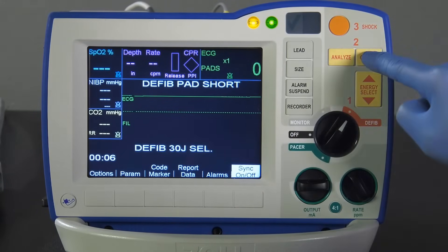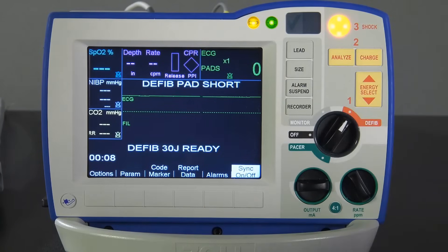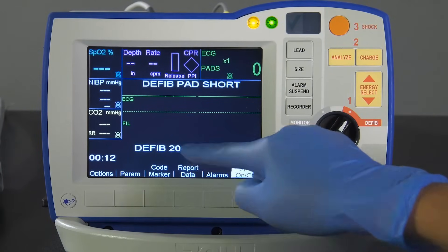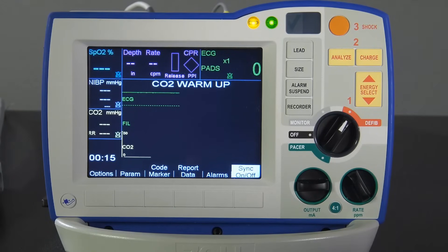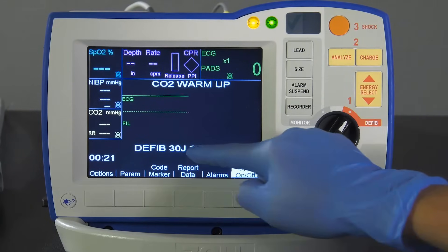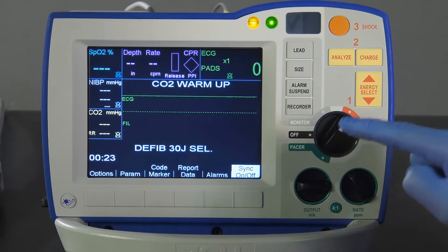When the Charge Ready tone sounds, press the down Energy Select button until 20 joules is reached. The defibrillator will disarm itself. Press the Energy Select buttons to reset the energy to 30 joules, then press the Charge button.